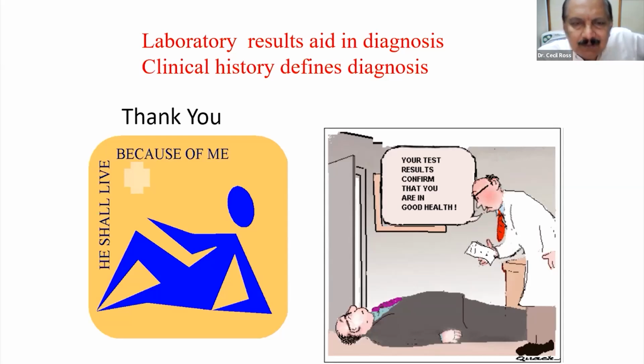Yes, the young male fellow was APL because he had recurrent DVT. The lupus anticoagulant was positive, the anticardiolipin antibody was negative, and ANA was positive. So it is APL.